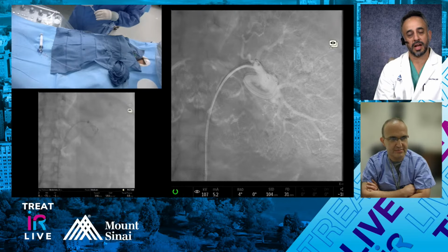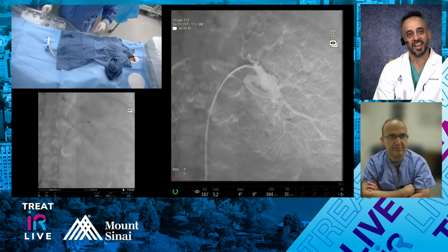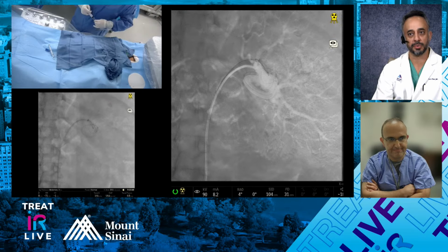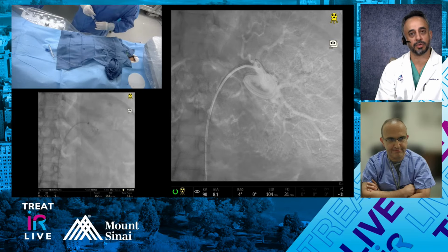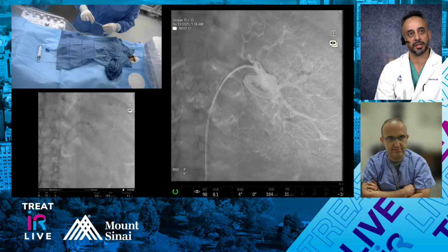I guess we're in agreement. If there's a more proximal aneurysm in the main splenic artery, I would maybe do the outflow, the aneurysm, and then the inflow, like just sort of coil across. But distal here, I think you're just going to pack it and then maybe coil the inflow a little bit, or plug the inflow if you want.